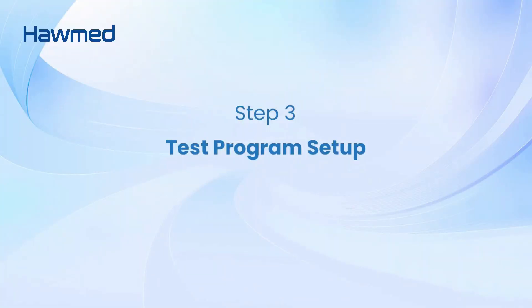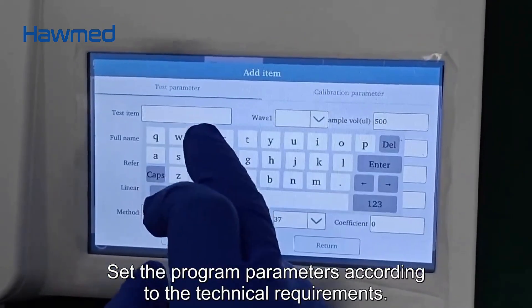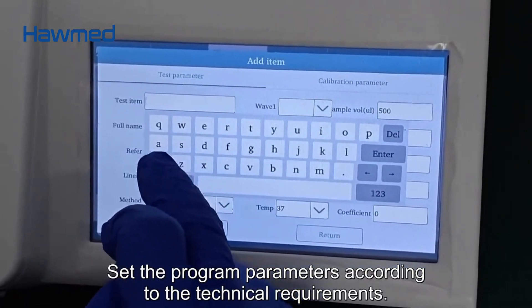Step 3: Test Program Setup. Add a new test program and set the program parameters according to the technical requirements.